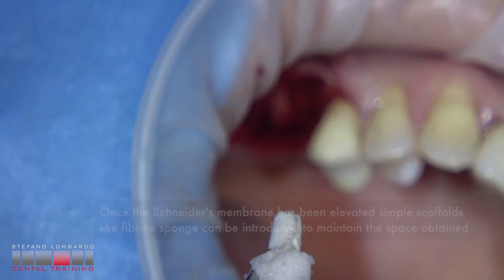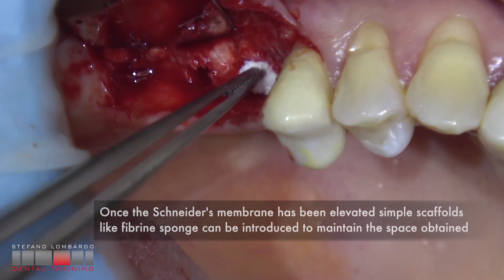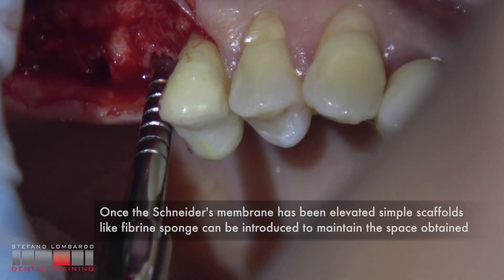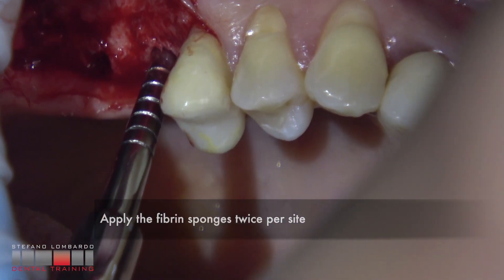Once the Schneiderian membrane has been elevated, simple scaffolds like a fibrin sponge can be introduced to maintain the space obtained. Apply the fibrin sponges twice per site.